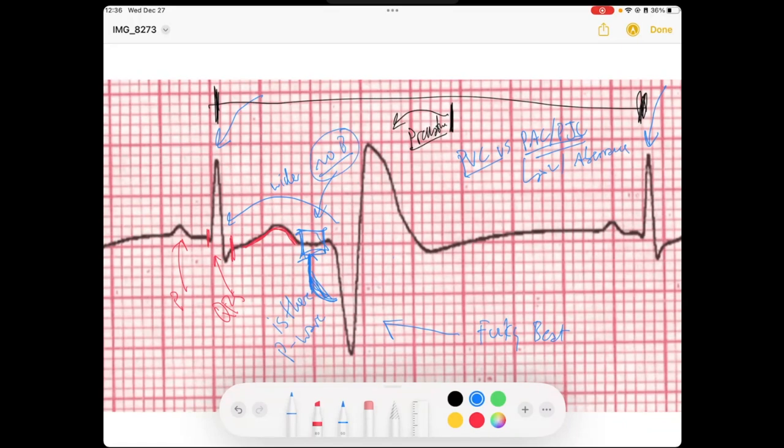And so we can then say that this wide complex QRS with this funky T wave, because we know that this is a PVC. We're going to say this is a PVC.